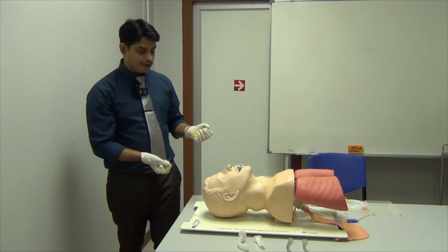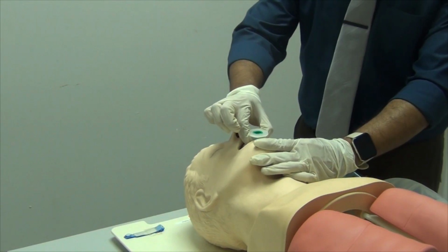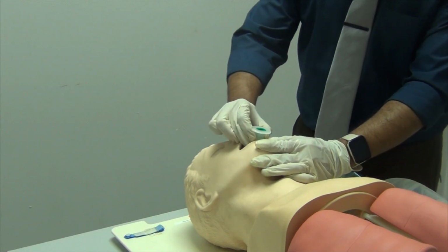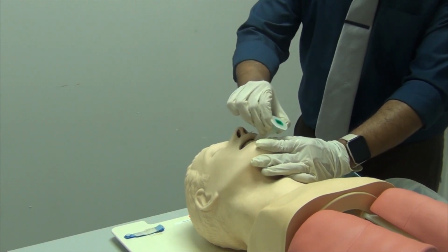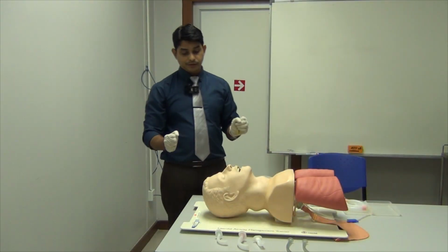Removing the OPA is done in the same curvature. This is the curvature along the hard palate. Just remove the OPA when the patient regains consciousness and is doing better.